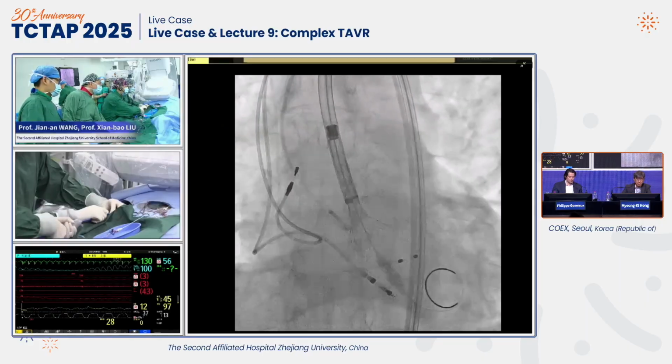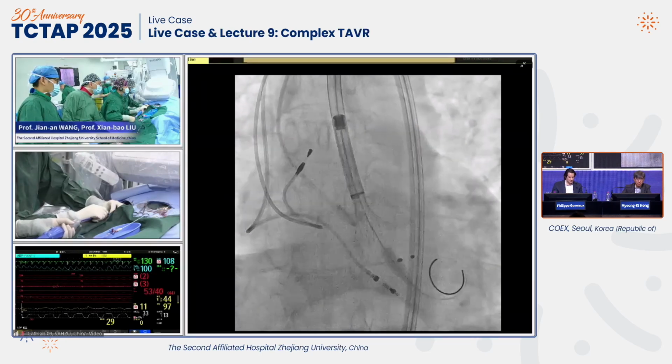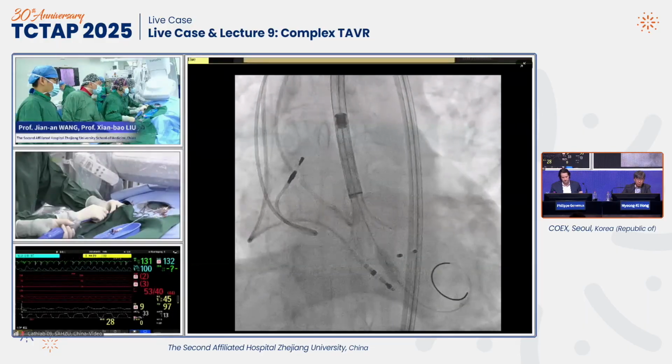Also during the recapture, have maybe a partial recapture and push on the wire. Yeah, partial. Yes, I agree. Push a little bit on the wire, exactly, and then continue. I think it's a very good technique.